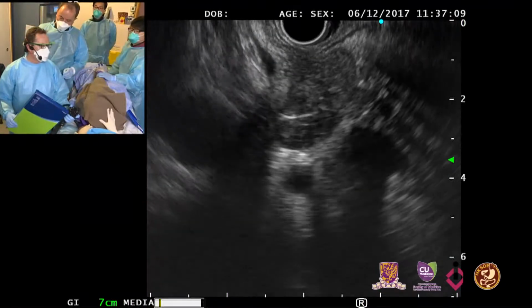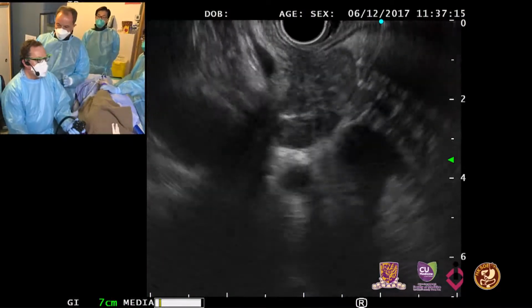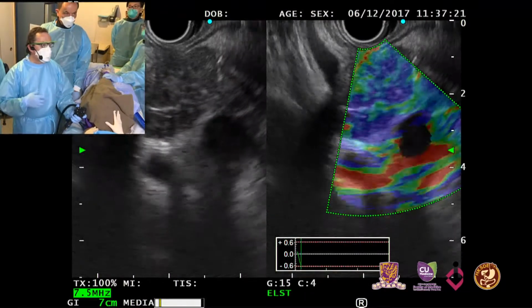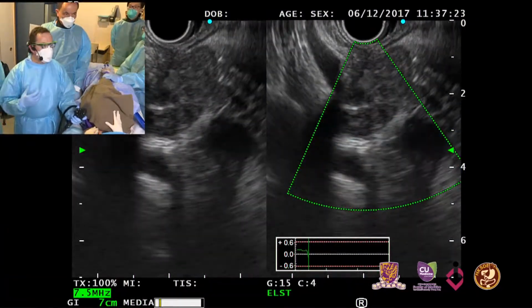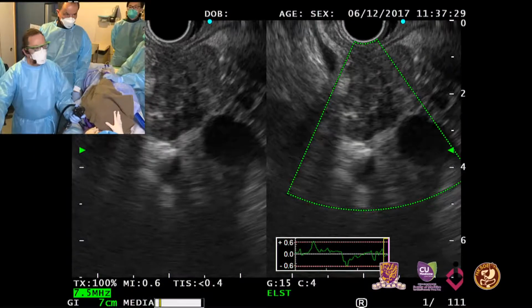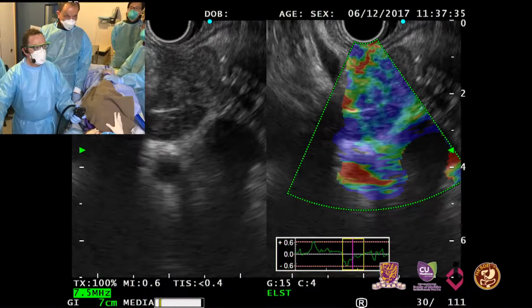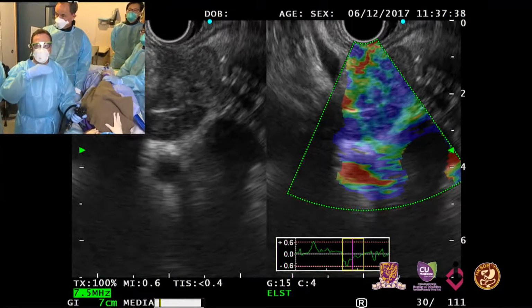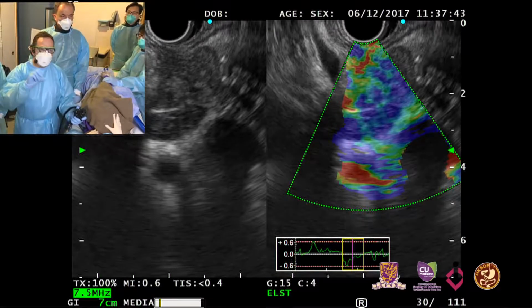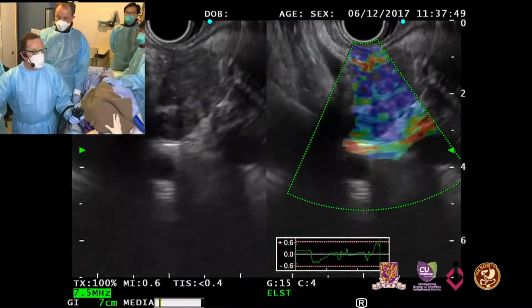Would elastography or contrast enhanced US be helpful for differentiating? Absolutely. And we can show elastography for a second. It's going to show whether it's a hard node, and it would look all blue, or whether it has all these different colors. The closer to green and red is soft, and the closer to blue, it's hard. Elastography represents the elasticity of the tissue against the probe.